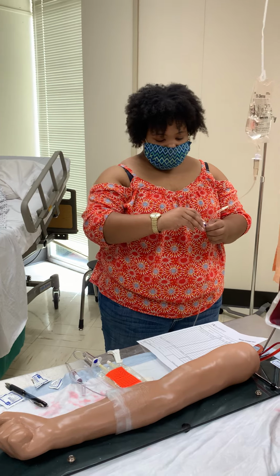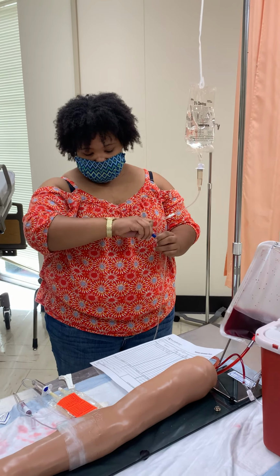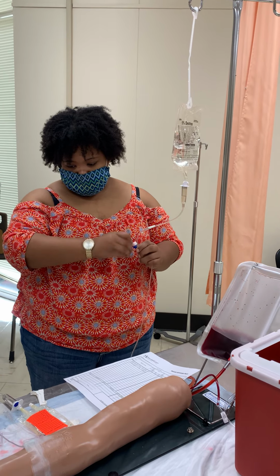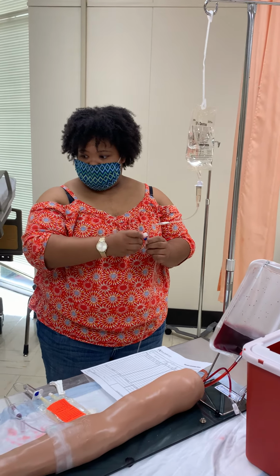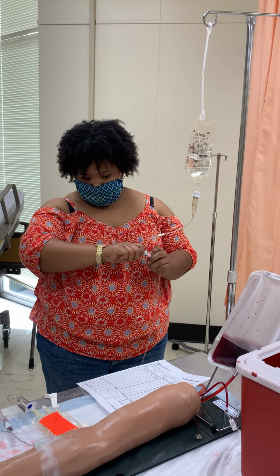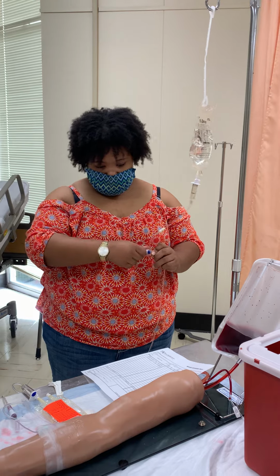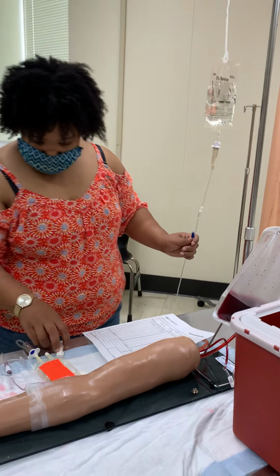So now I'm going to clean my port for 30 seconds, okay? Okay, so gotten that clean. All right.